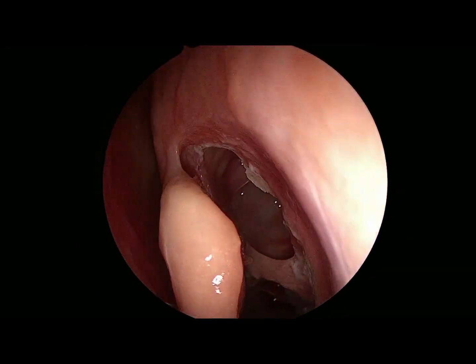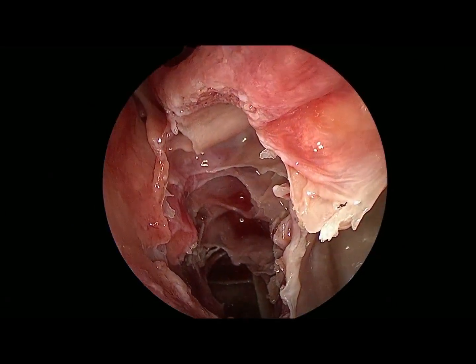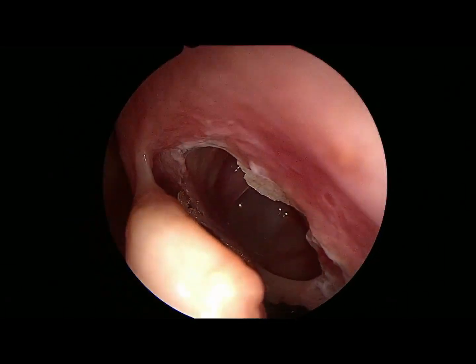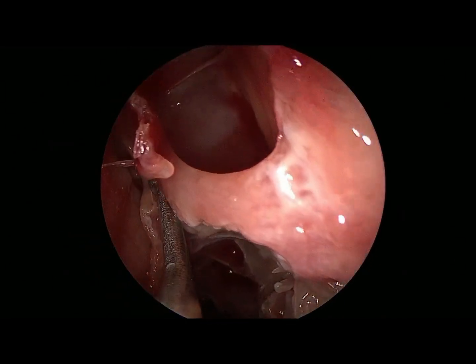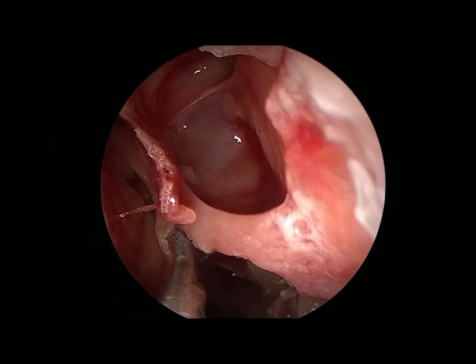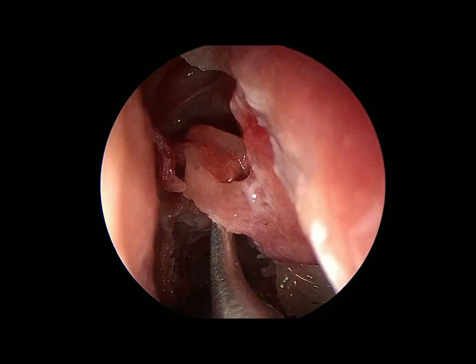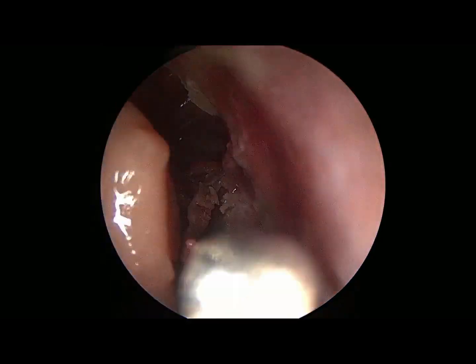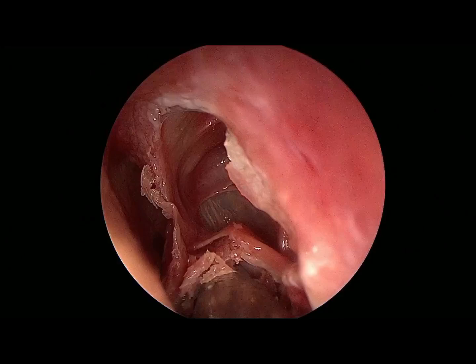Once the anterior ethmoidectomy is done, the last step is to do a frontal sinusotomy. So in this scenario, you can see a big agger cell is there. Now I am going behind the agger cell to remove the posterior wall of the agger cell. Once you remove the posterior wall of the agger cell, then you see the frontal sinus drainage pathway.